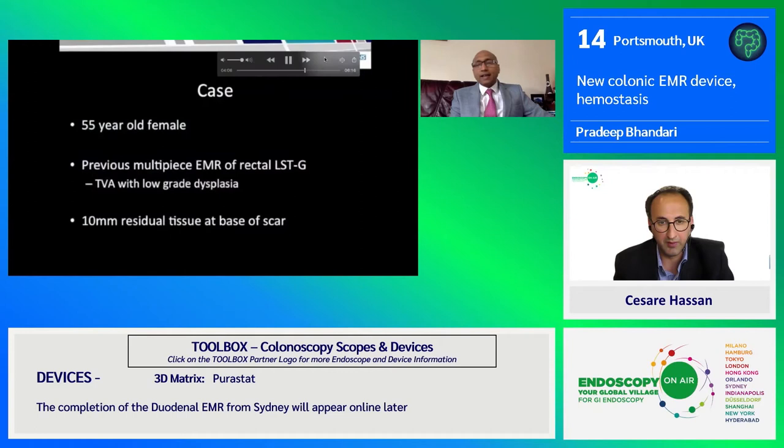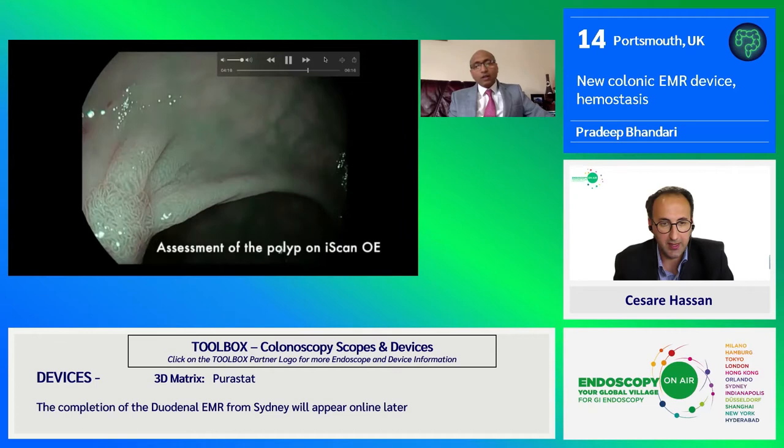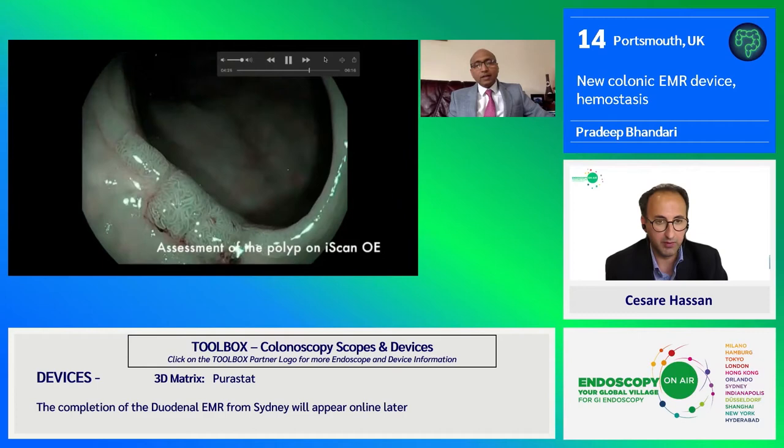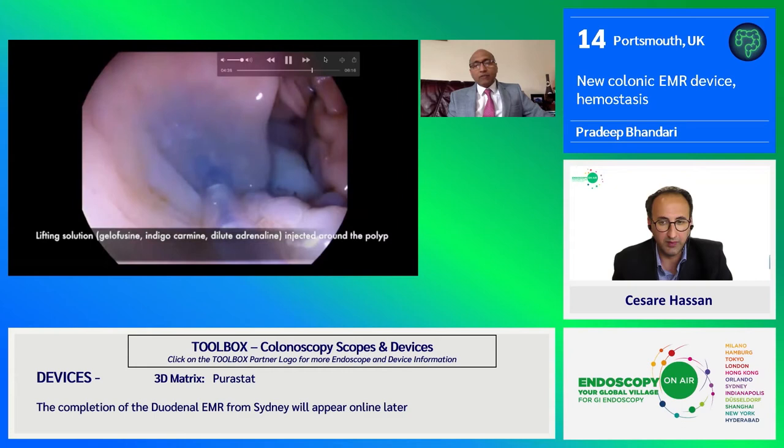Moving on to the next topic of this novel non-diathermic resector called Endorotor. This is the patient who's had previous EMR and recurrence of an adenoma on the EMR scar. That can be very challenging, and when it is a scar lesion like that, it's very difficult to resect by conventional EMR or ESD technique.